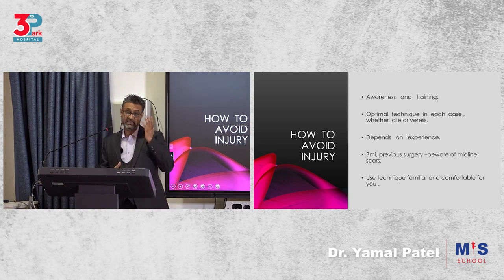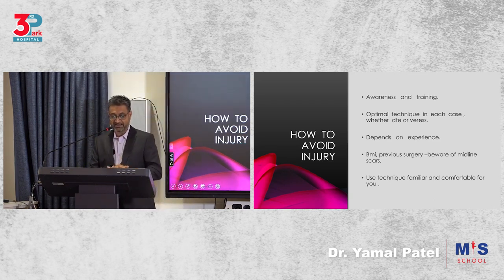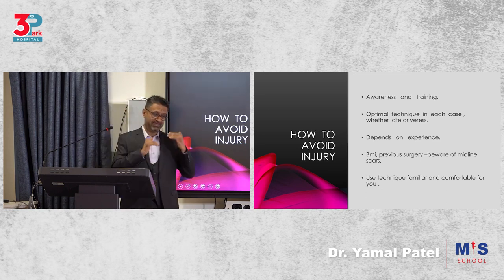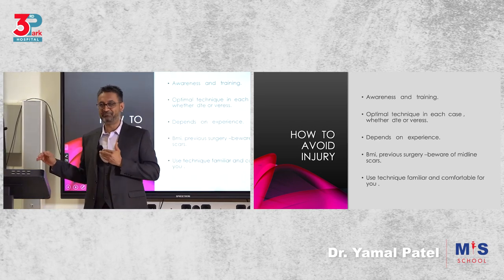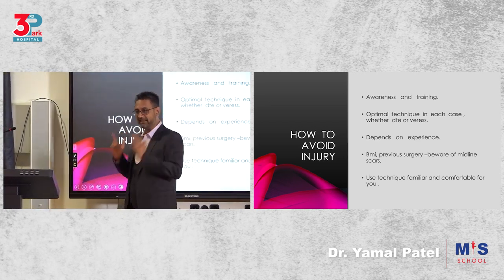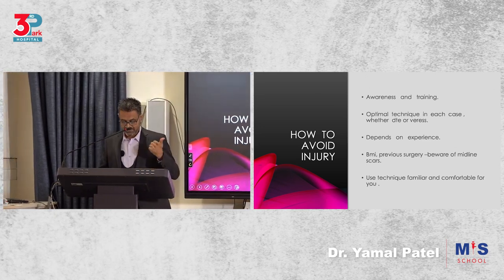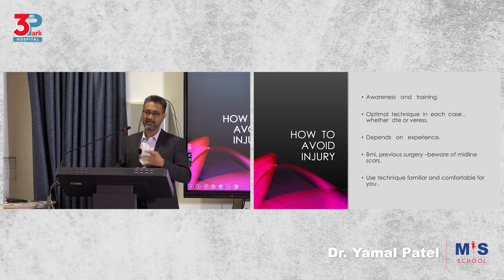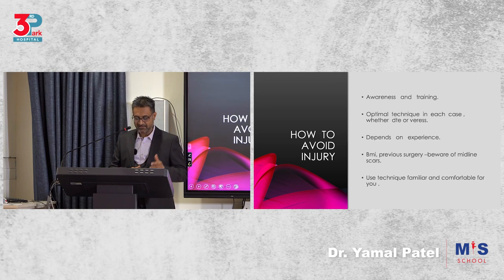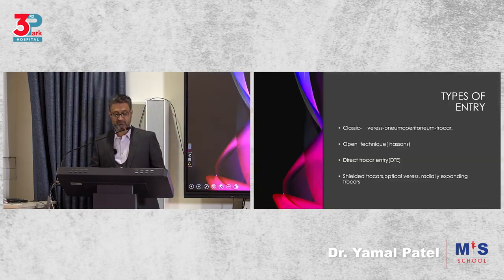How to avoid injury? Obviously, awareness and training, as we are doing, and optimal technique. So there is a technique process. You do not bypass any step there. Everything needs to be done in the right way. It depends on experience over time, and then you have to be careful about these high-risk ones like high BMI, obese, previous surgeries, etc. And then start using a technique that you're familiar and comfortable with.